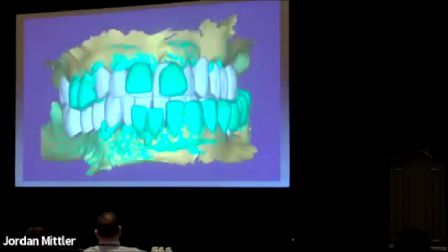Okay, so now what we've done is we have our intraoral scan, and obviously the teeth in blue here are her existing dentition, and the white is starting to figure out where we want to be. And there was one miracle that happened in this case, and that miracle was that tooth number 8 is lined up perfectly at the midline. I don't know how that managed to stay that way, but you know, we use the floss, we look at the patient's facial aesthetics, we do facial analysis, and the midline is actually right where that central incisor number 8 is supposed to be.